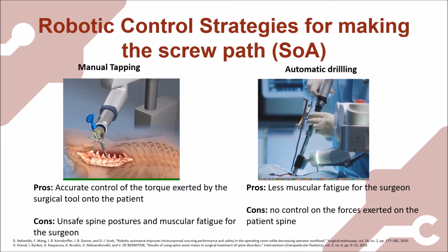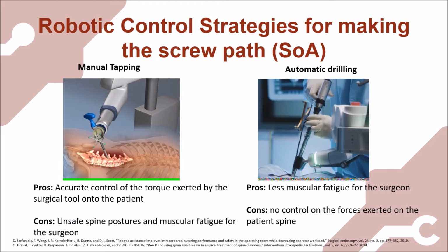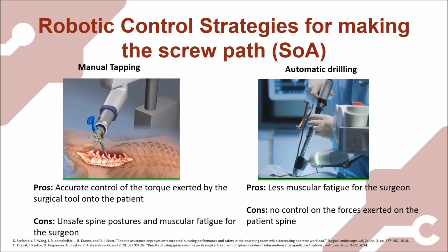In clinical practice, the screw path is achieved either by drilling or tapping the pedicle. Pedicle tapping, differently from the drilling, consists of threading the patient's pedicle for a more accurate screw insertion. However, control strategies able to automate this procedure are still an open issue, and pedicle tapping is still manually performed by the surgeon, who is exposed to uncomfortable postures and muscular fatigue.